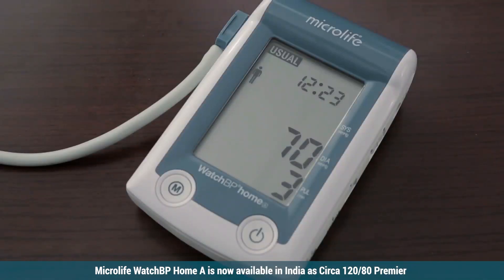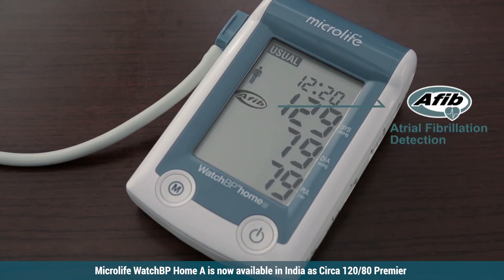WatchBP Home A screens for atrial fibrillation during blood pressure measurement. The AFib icon will flash when the device detects AFib.